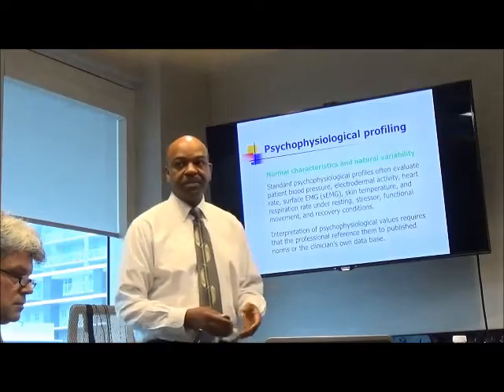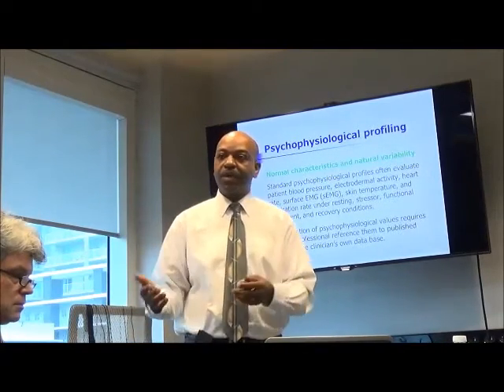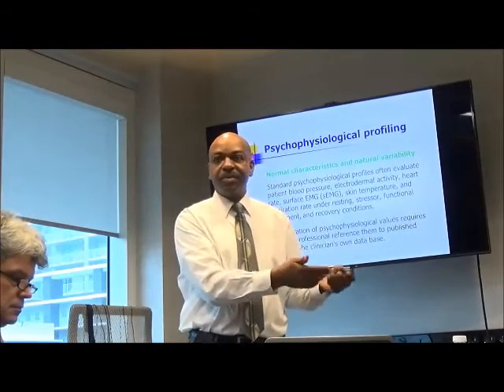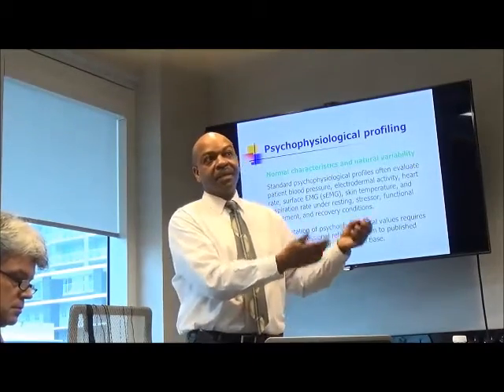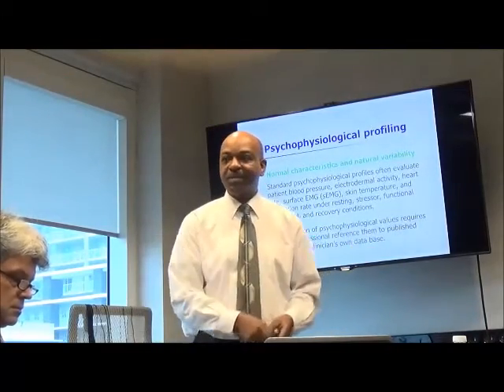I've seen it many times, some people don't do stress assessments, and then they just pick what modalities they're going to work with, maybe because they look in the textbook and it says for headache you do EMG and temperature, and so they start doing EMG and temperature.